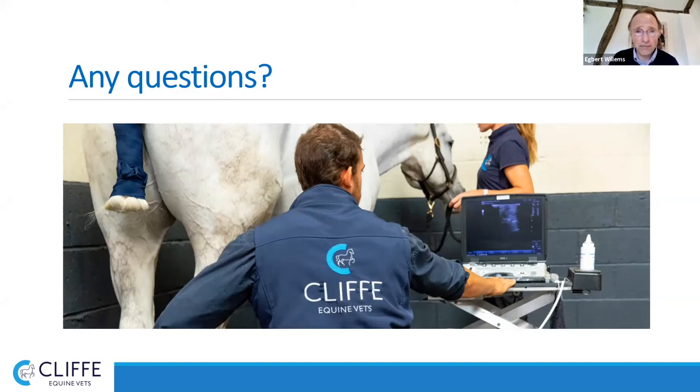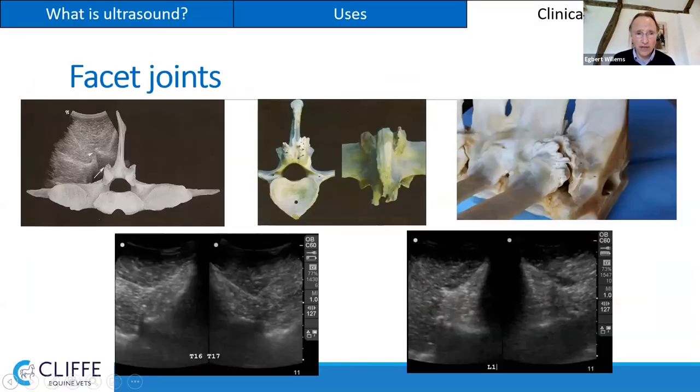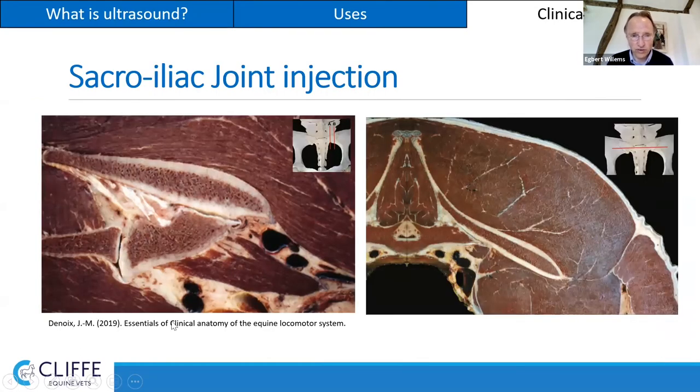Oh, and another one here from Maretta. From what angle or direction do you ultrasound the SI joint to visualize it, and from what angle or direction do you inject? Again, another good question. The SI joint is normally visualized from underneath, so actually per rectum. We do a rectal examination where we look with the ultrasound probe upwards to see the area of the joint, and particularly it's on the caudal end of the sacroiliac joint that you see most changes. And that is something that we can really see on an ultrasound scan.